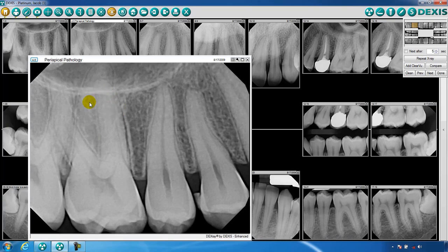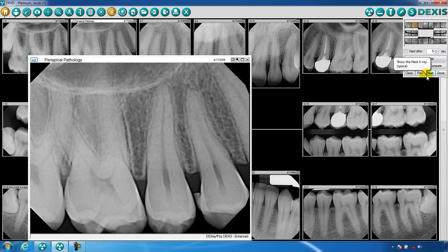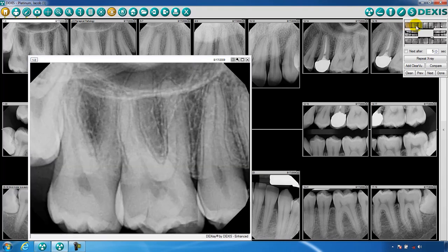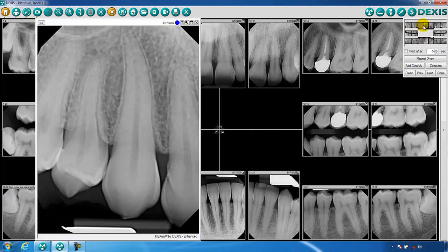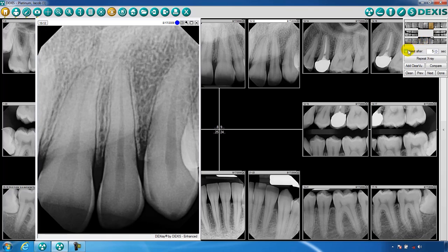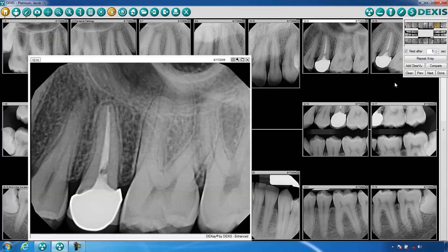Each time you enlarge an image on the screen, a screen with thumbnail images will appear in the upper right corner. This screen is called the navigator. The navigator will allow you to scroll through your enlarged images by clicking on the thumbnail images. You may automate this feature by clicking the Next After box.